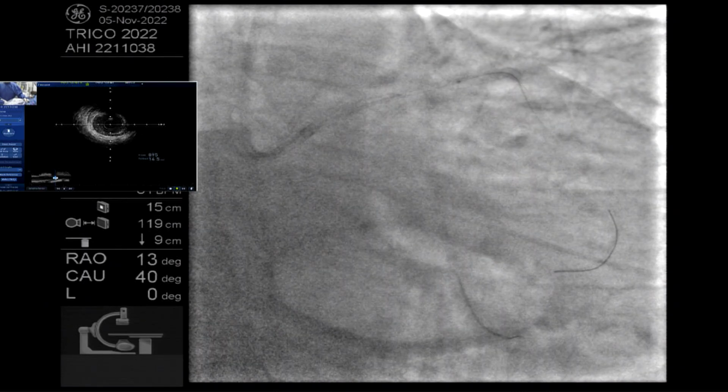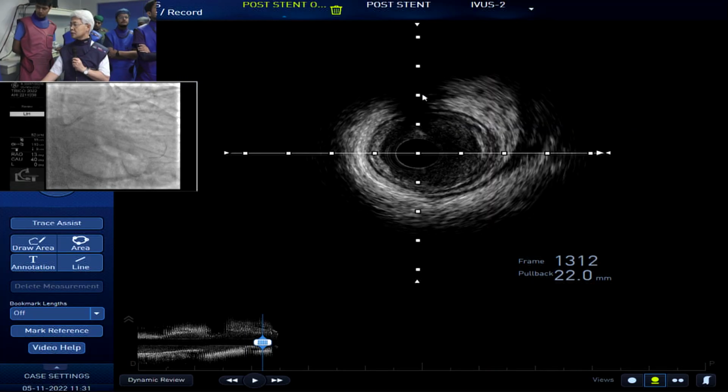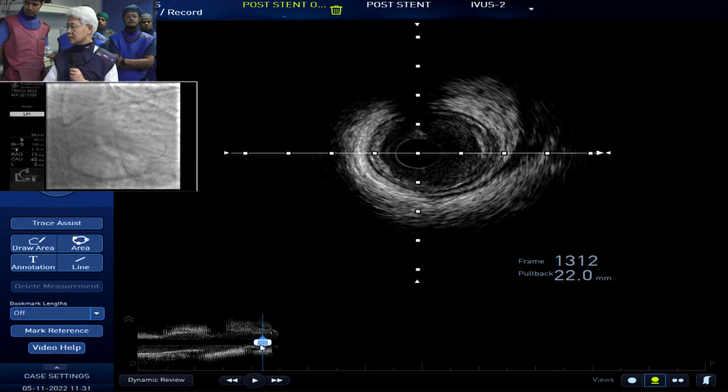Dr. Akasaka, could you explain a little bit about the entry in the proximal site? Yeah, if there is some entry in the proximal site, I'm afraid to expand much more. But there is no entry site in the proximal site. We still have a hematoma here, I think, but I cannot identify any entry in the proximal site, right? You mean in the main circumflex?